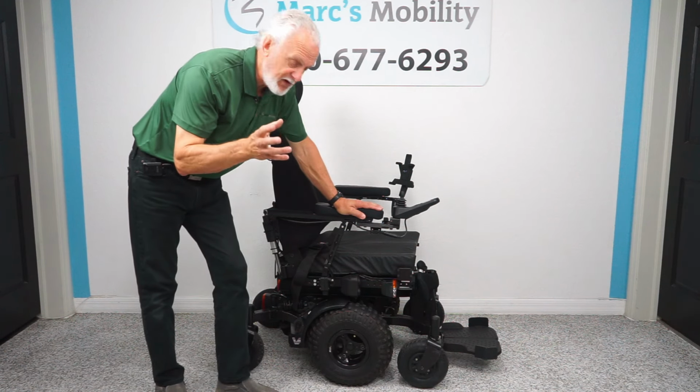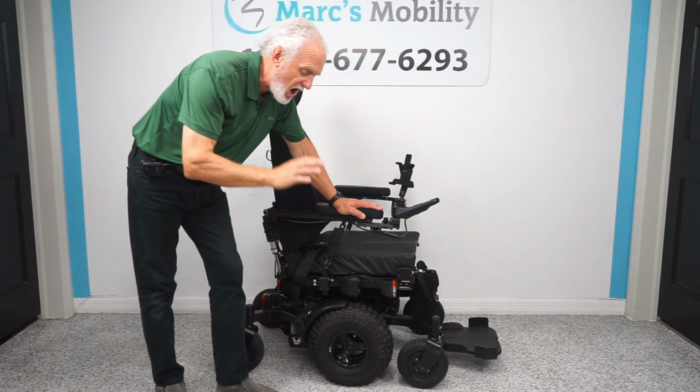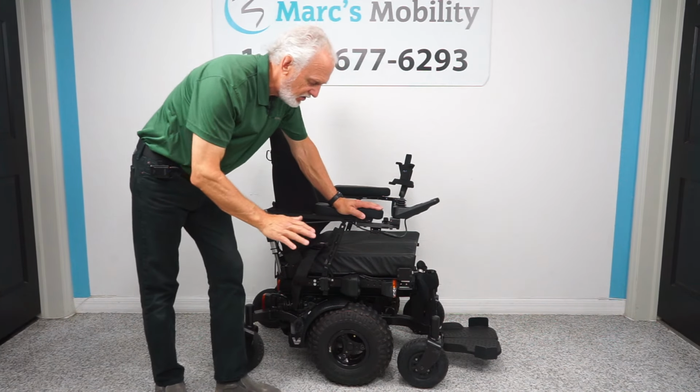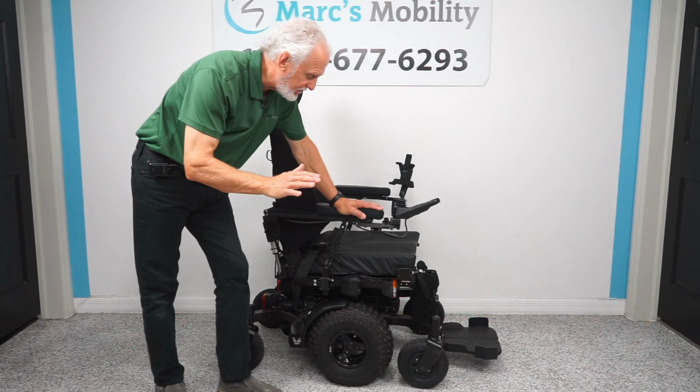Now, this is an extreme power chair. What that means is this chair will go everywhere but the beach. So the hot sand on the beach, when you get to the hot sand before you get to the ocean, you need 4 of these to get through that. It'll do everything but the beach, okay?